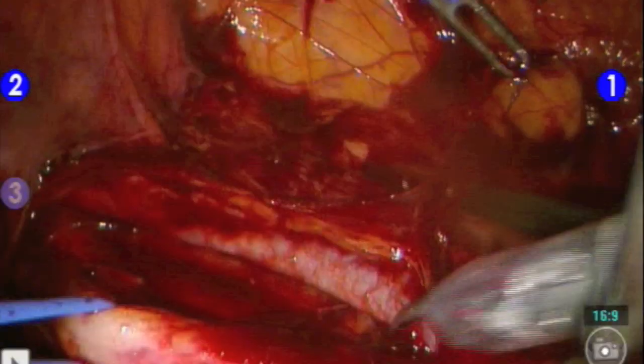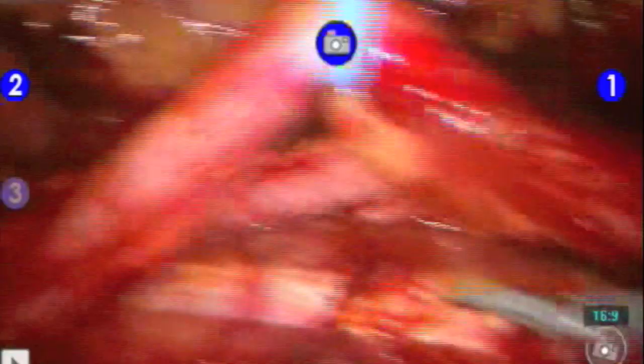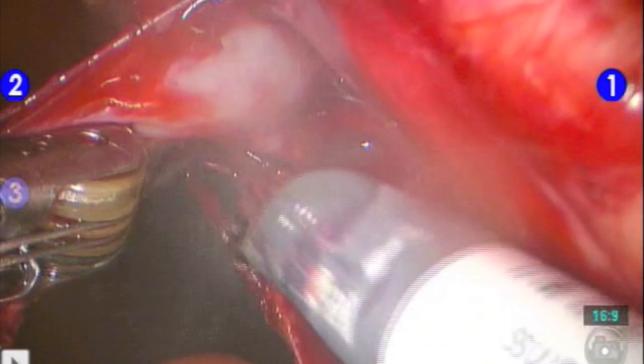As seen here, with the use of the vessel loop, the surgeon can clearly see the iatrogenic stricture, and dissection can be carried down caudally to the area of stricture where the ureter will need to be cut.